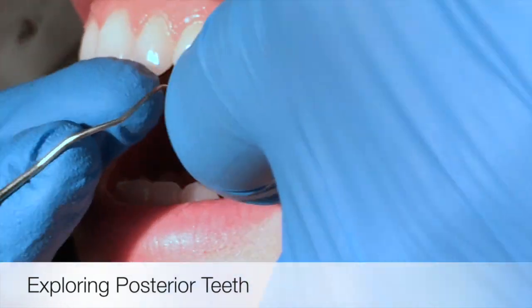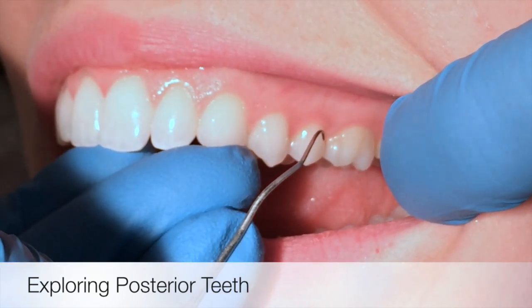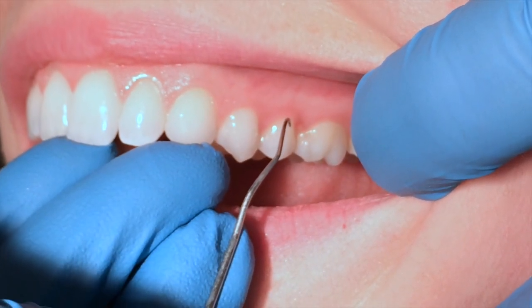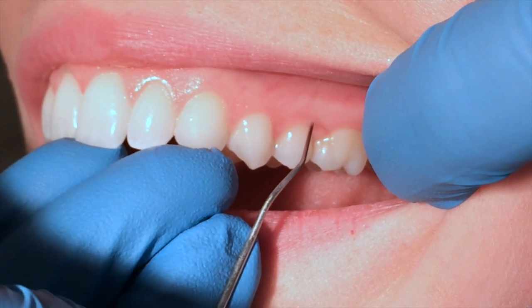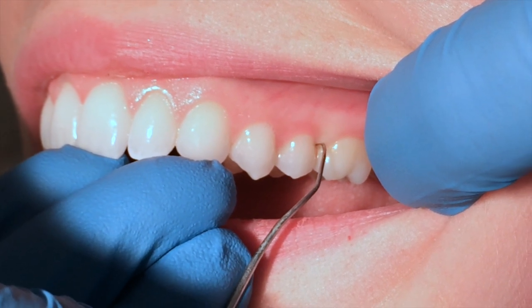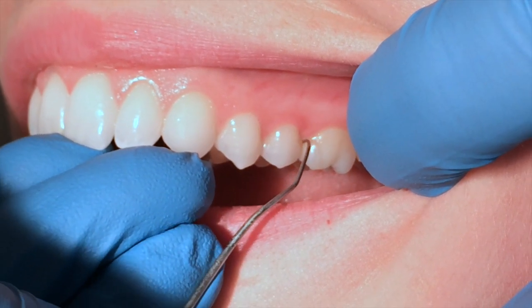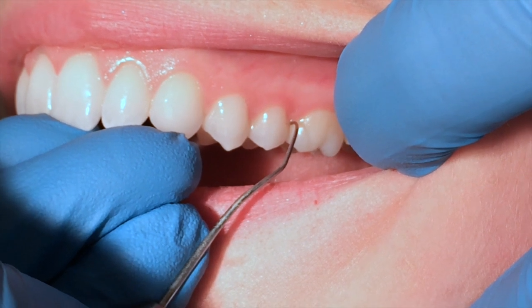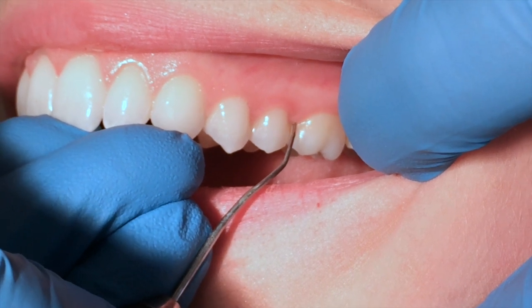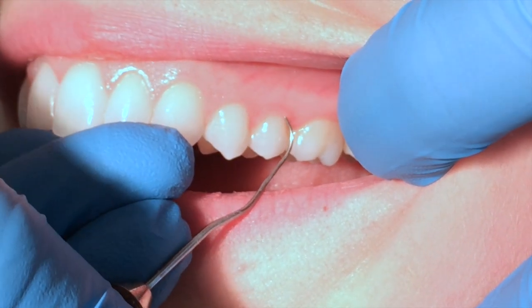I'm going to have Candy turn a little bit more towards me. I'm going to use my finger to retract, as I can see with my eyes and not needing the mirror to aid me in exploring these teeth here. I'm going to start distally and wrap around, making sure that I am extending adequately interproximately. Often times people stop right at that contact, but you need to go under the contact to assess whether or not there are calculus deposits. Withdraw, quarter turn, come across the facial.